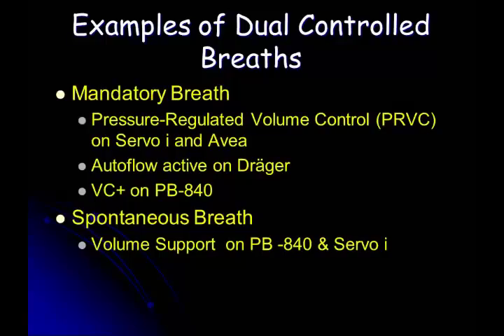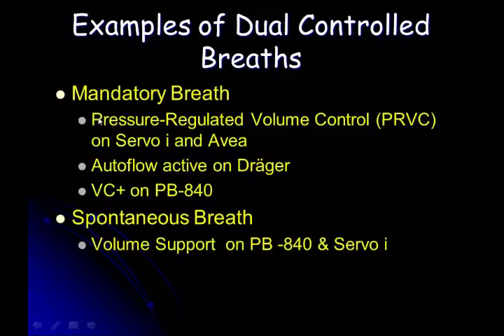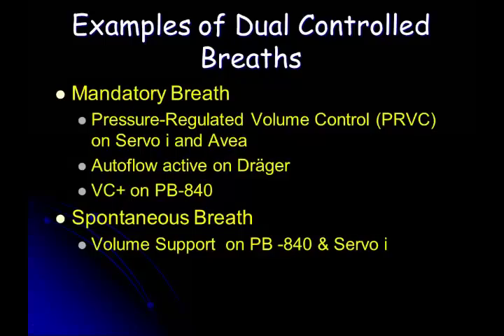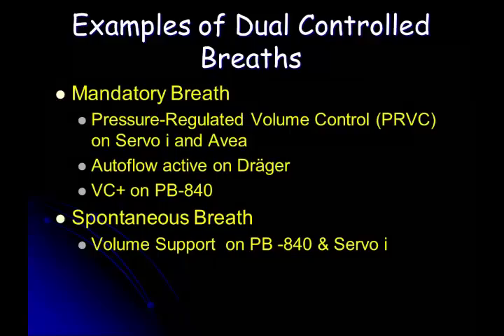So in the case of PRVC, pressure regulated volume control, it's really not volume control, it's a pressure controlled breath. It's volume targeted. Kind of a bad terminology they use there. That was the one where the salesman said it delivers the breath at the lowest possible pressure. Well, yeah. If it's seeing the volume being excessive, it bumps the pressure down. So if you have a pneumothorax, you just keep going and keep the volume you want.